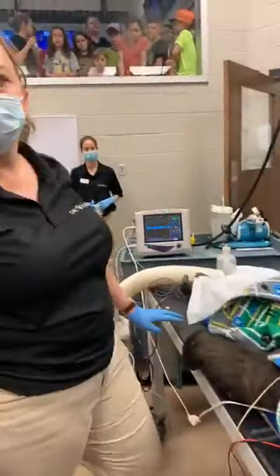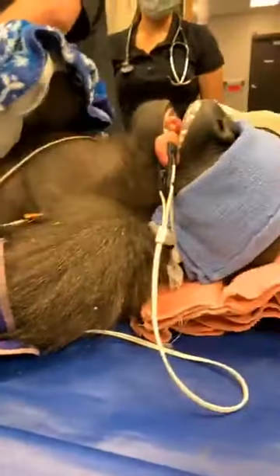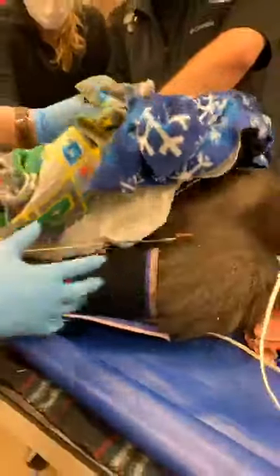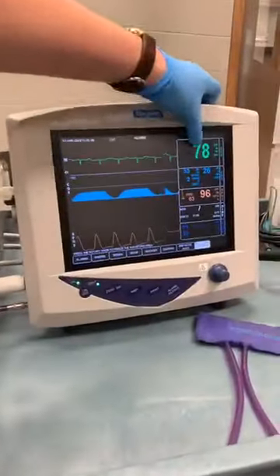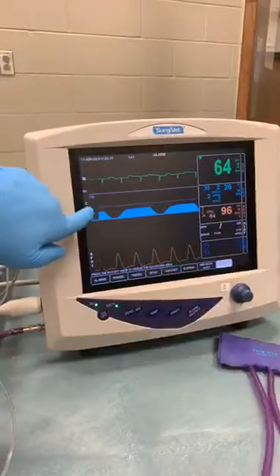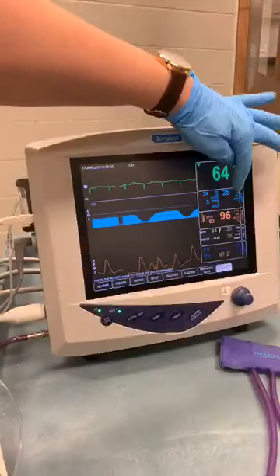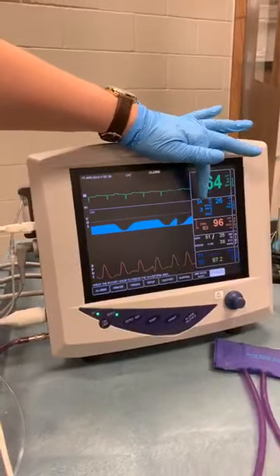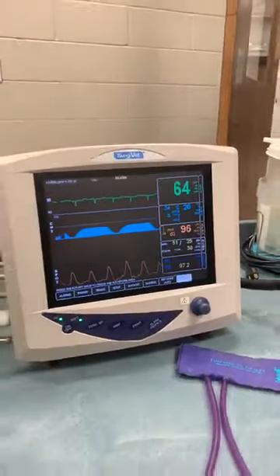Stephanie, can you talk a little bit about how you monitor Liam's vitals and blood pressure during the exam? Sure. So you can see we have all these cords coming out of him here. We have an ECG cord, a blood pressure monitor, and a pulse ox monitor. Just like you would when you go into surgery, we have all of our monitoring equipment attached. And then we have this machine over here that gives us all of our ranges. This one up here is his heart rate. Here's what his ECG looks like, the electrocardiogram, so that's what his heart is doing at the moment. Here's his breathing. This shows us each time he takes a breath, an inspiration and then he's blowing out. And then it gives us the numbers here so we know how many breaths he's taking per minute, as well as what his carbon dioxide levels are. We have our oxygen level. He's at 96% oxygen, which is a really good oxygen rate.